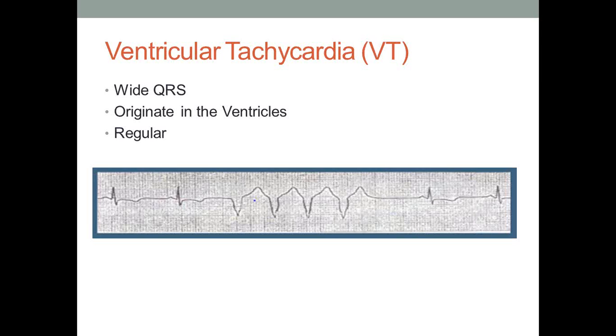Ventricular tachycardia is different. Ventricular tachycardia originates in the ventricles. How do we know that? Because the QRS complex is wide. It's wider than 3 little boxes, or wider than 0.12 seconds. Anytime an impulse originates in the ventricles, it is wide. So VTach requires PVCs, so each of these would be considered a PVC. However, a run of at least 4 of them is considered VTach.